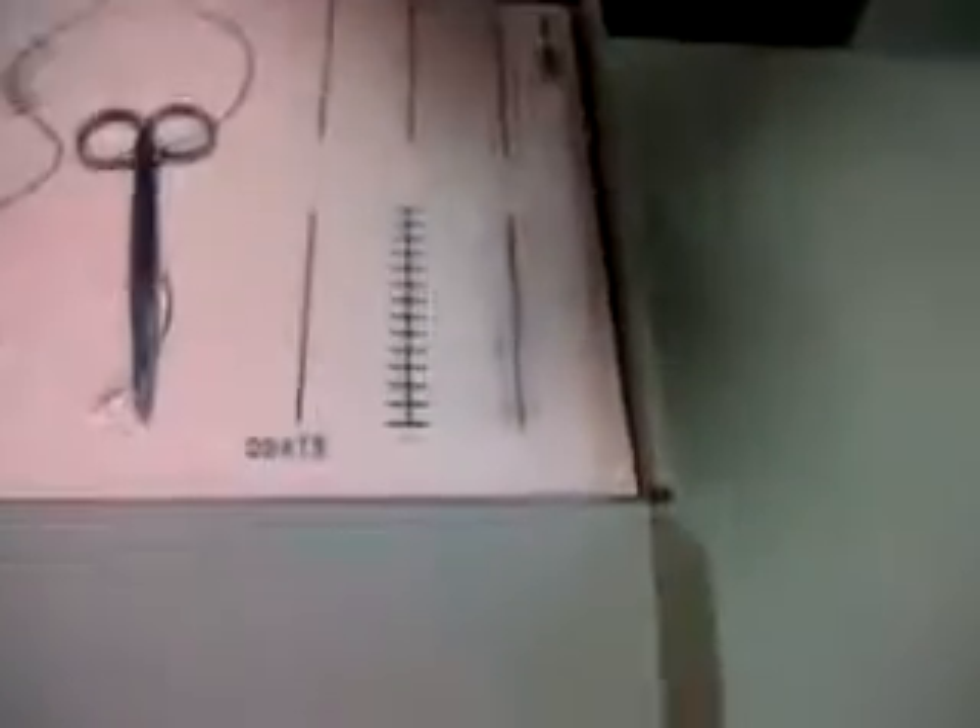Hold it and again cut. Vertical mattress, horizontal mattress — so now all of you can practice.